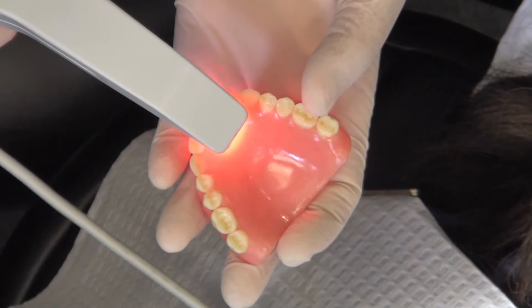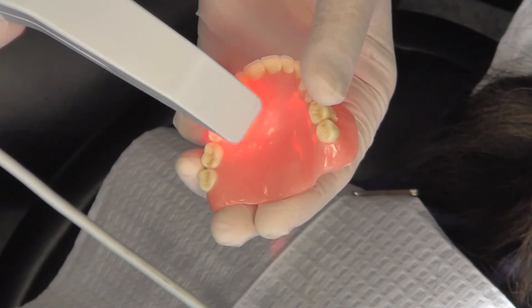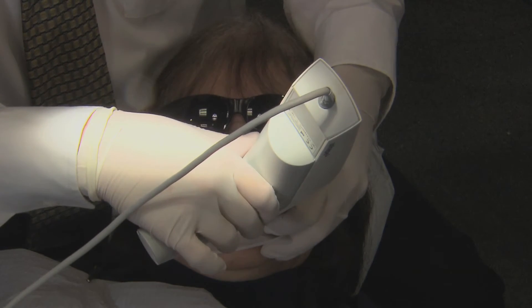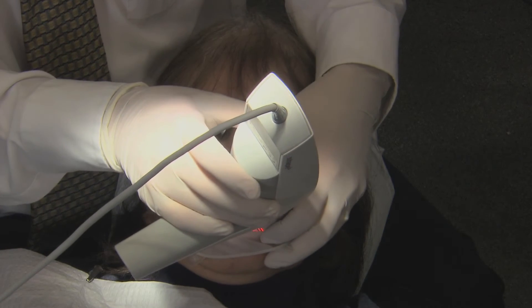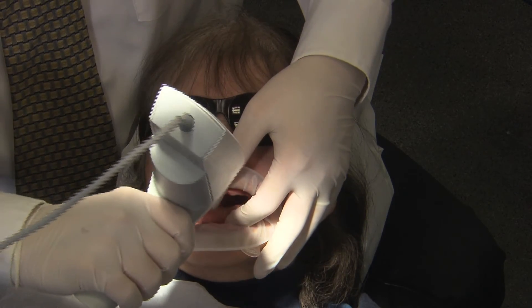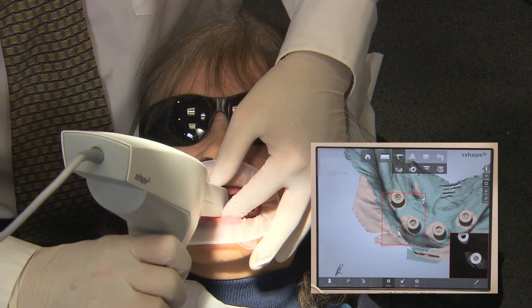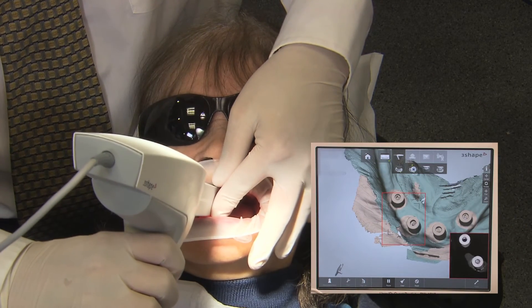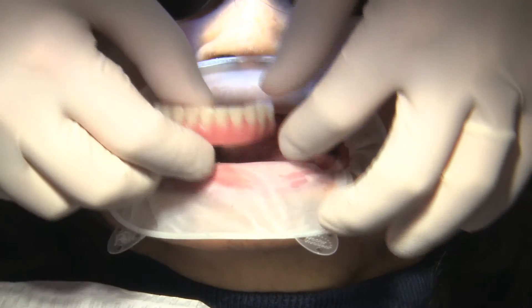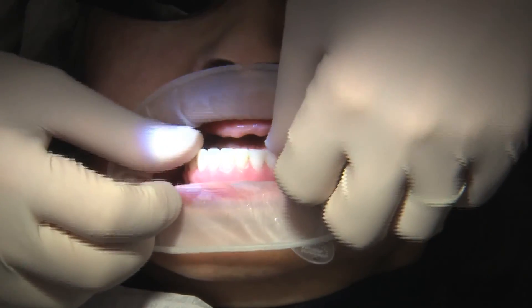Next, the opposing dentition was scanned. Because a denture served as the opposing dentition, we scanned it extraorally. The patient was then asked to close and the bite was scanned in maximum intercuspation. We then removed the provisional, attached scanning fixtures to the multi-unit abutments, and scanned the restorative arch, taking care to capture the same adjacent anatomical landmarks as the first scan of the provisional. After intraoral scanning was complete, the provisional denture was reattached to the multi-unit abutments.